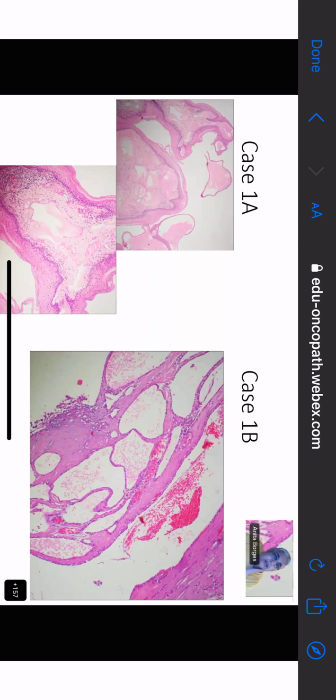Okay. Vimi? Ma'am, one cell is secreting, but it should not be included in a histopathology description, I think, ma'am. Secretions are not to be included in a histopathology description, Vimi.